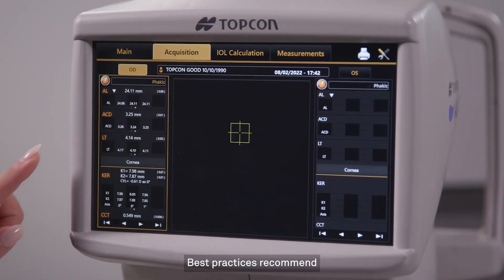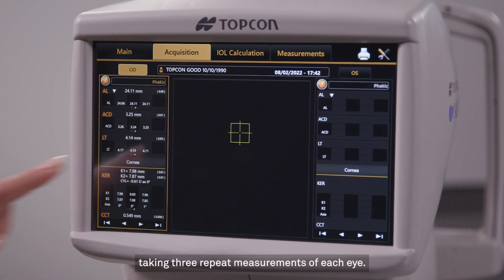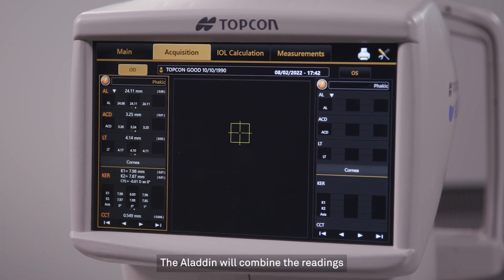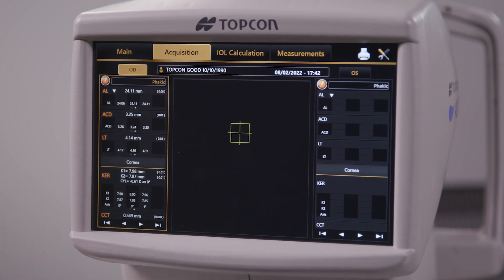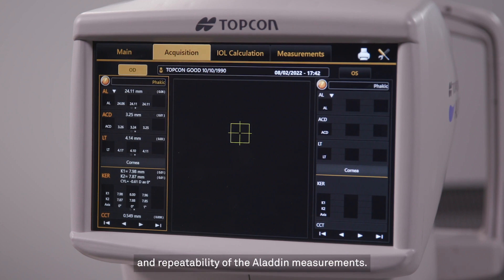Best practices recommend taking three repeat measurements of each eye. The Aladdin will combine the readings and provide an average. Published data confirms the accuracy and repeatability of the Aladdin measurements.